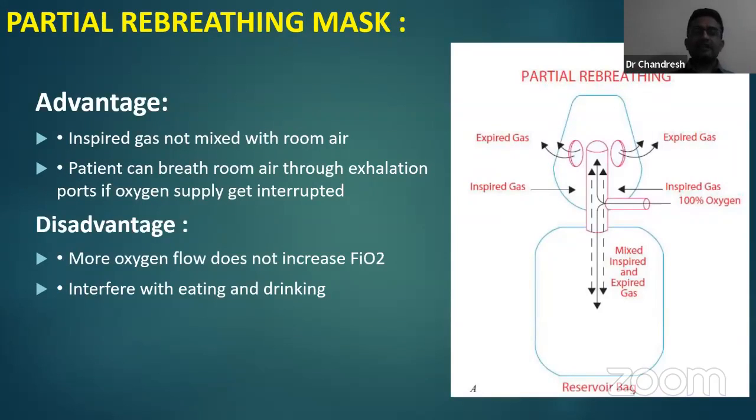What are the advantages? Inspired gas here is not mixing with the room air. With the partial rebreathing mask, the patient can breathe room air through the exhalation ports if by chance the oxygen supply gets interrupted, because the side ports are open. Disadvantage, yes, more oxygen flow does not increase the FiO2 here, and it always interferes with eating and drinking like the simple face mask.